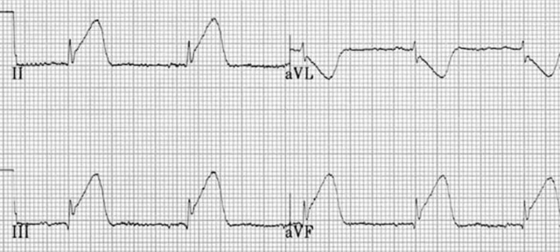So I had a patient the other day who had ST elevations in leads 2, 3, and AVF. So show me by pointing with your arms where on EKG man that would represent. And AVF. So they're all looking inferiorly, right? So if you are seeing ST elevations in leads 2, 3, and AVF, you're looking at an inferior MI.